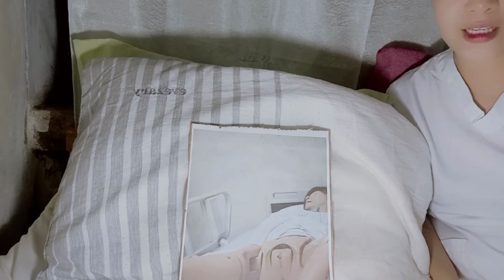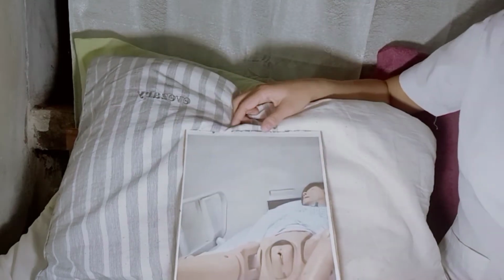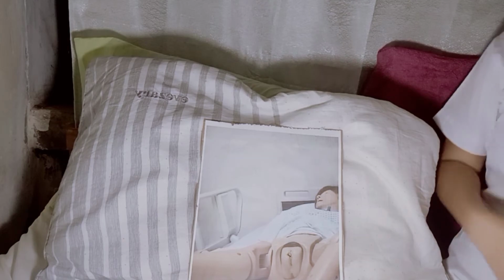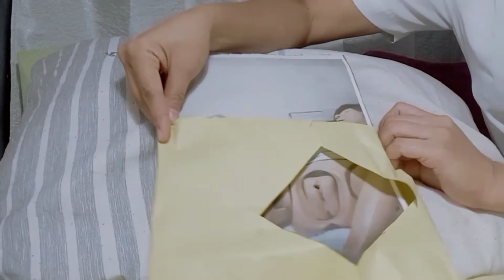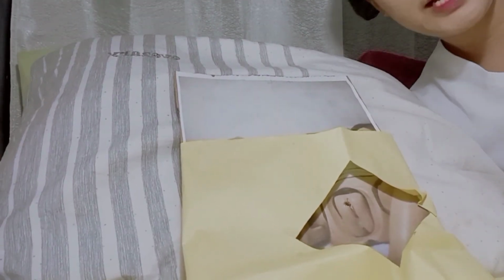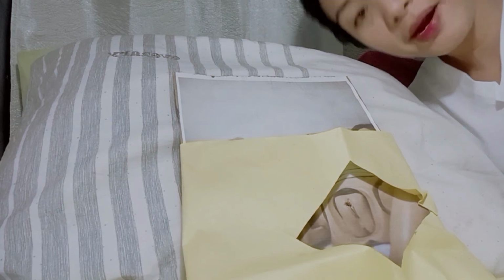The 7th procedure is to position the client in dorsal recumbent, then expose the labia. And then drape the client so only the perineum is exposed. This provides privacy and reduces embarrassment.